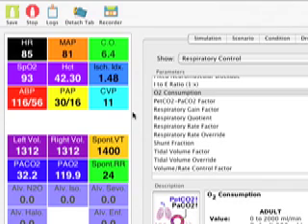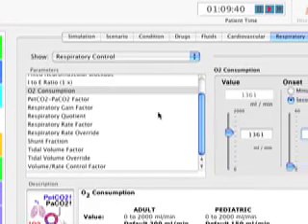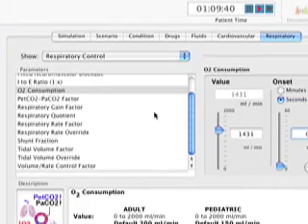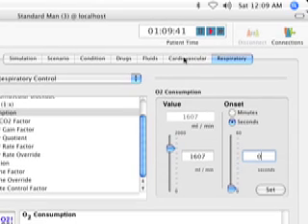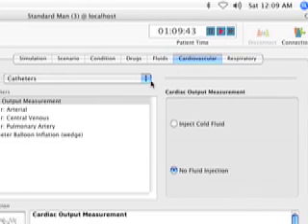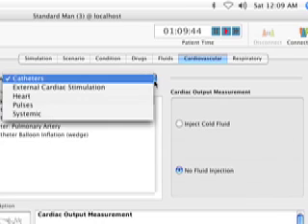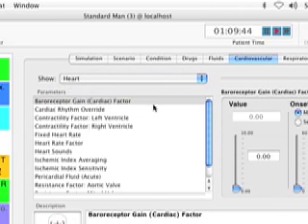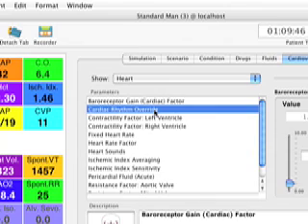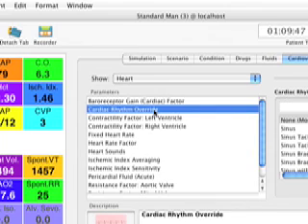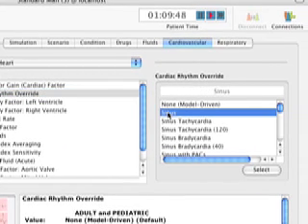As I mentioned, if his sat falls too much, he may go into cardiac arrest, and that may be desirable or undesirable in the scenario you have. So I'm going to click on the cardiovascular tab, and I'm going to go down to the heart drop-down, and in cardiac rhythm override, I'm going to choose sinus. So now that he's in sinus rhythm, no matter how low his sat goes, he will not go into cardiac arrest no matter what.